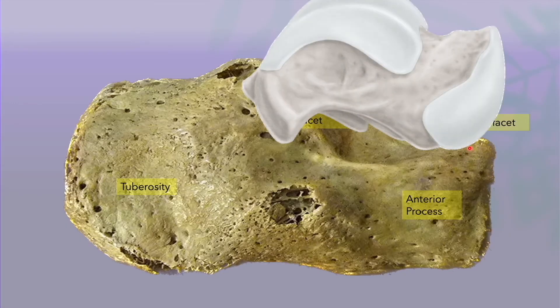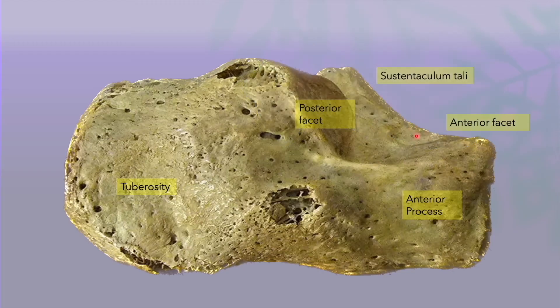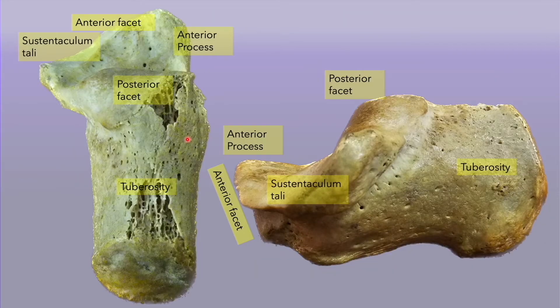This part of the calcaneum is the anterior process, just anterior to this angulation. This whole area is the sinus tarsi, which is the non-articular space between the talus and calcaneum. And here originates the extensor digitorum brevis. This area is also important to visualize the posterior facet whenever we are approaching the calcaneum through the sinus tarsi approach.